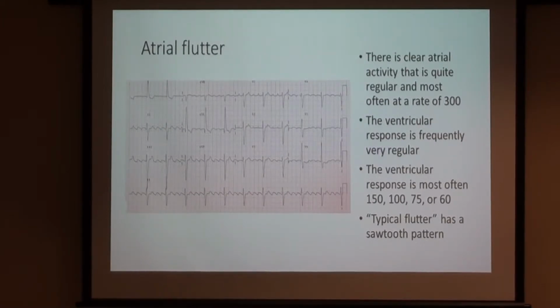Flutter is often a little different. With flutter, the atrial activity is usually more organized and tends to be of higher voltage, so it's usually more easily seen.